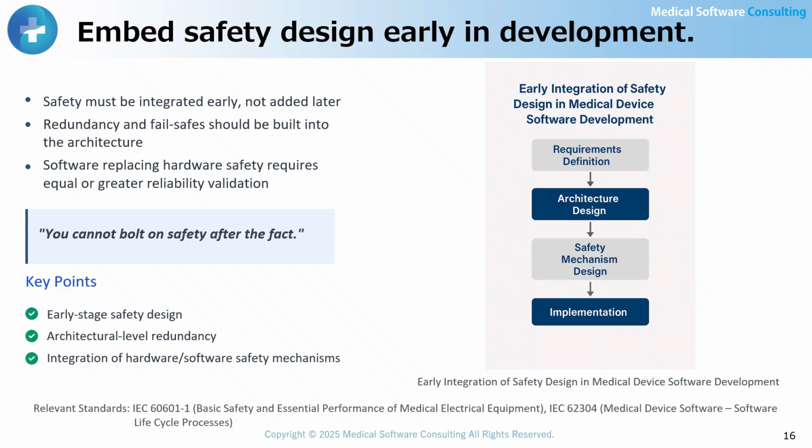Safety in medical device software cannot be added as an afterthought. From the earliest stages of design, especially during architecture design, it is essential to plan for redundancy and fail-safe mechanisms. If hardware safety features are replaced with software, the software must be proven through testing and analysis on the actual device to provide reliability equal to or greater than the hardware it replaces. Nancy Leveson's statement, "Safety cannot be added on later," is particularly symbolic. In the case of the Therac 25, hardware interlocks were removed and safety was entrusted to software alone. This led directly to radiation overdose accidents.